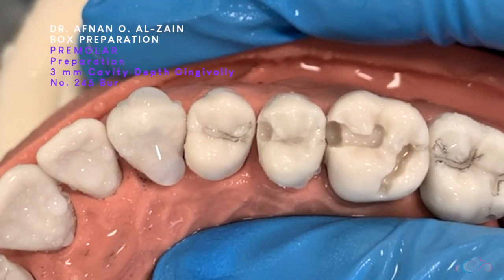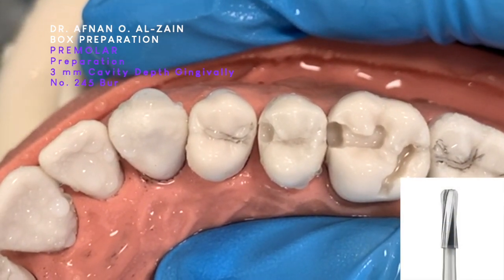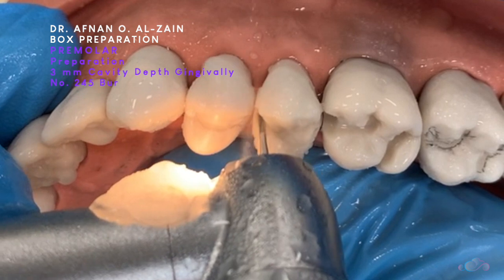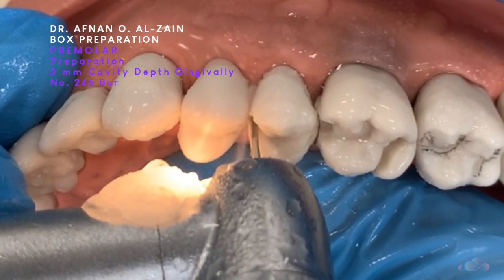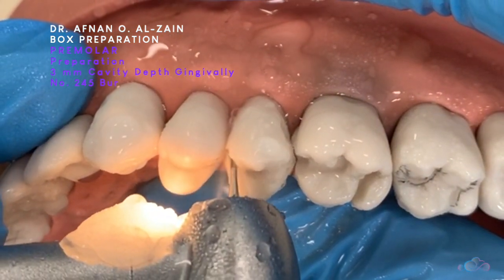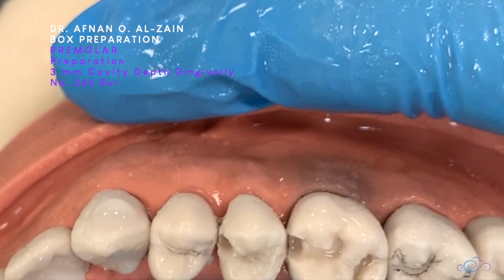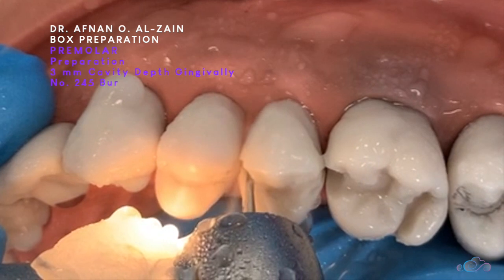So now we are going to reach the desired depth. We are going to use the 245 to go deeper in the box — you can do it from the beginning with the 245. We will continue defining the walls.